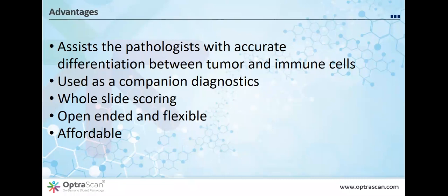Yes, Dr. Taylor. So there's another question which says, what do you think was the reason that the interpretation of all the PD-L1 tests have been designed to be so complicated? Well, yeah, I think in part, it's the process by which the pharma companies took these tests to initially the FDA.